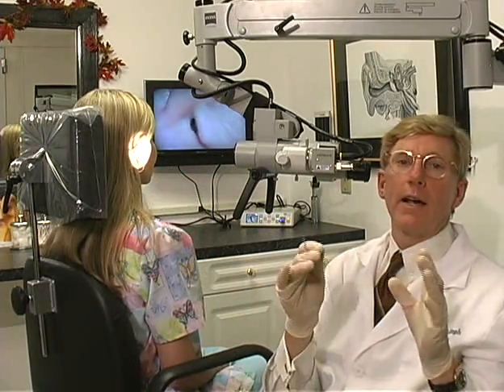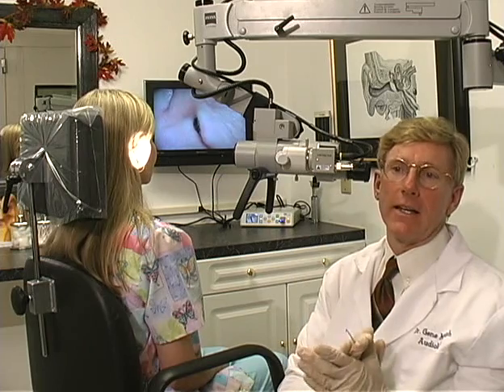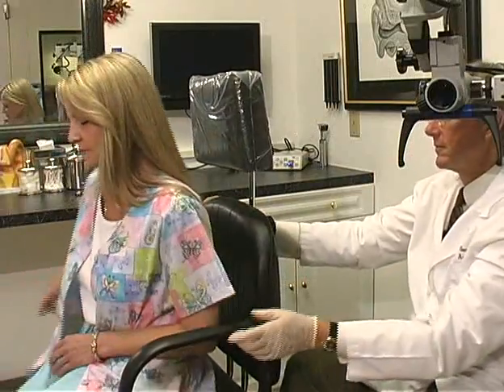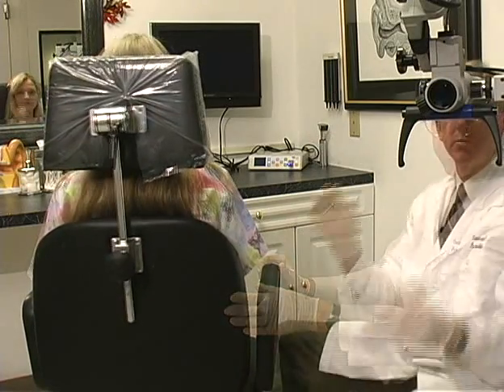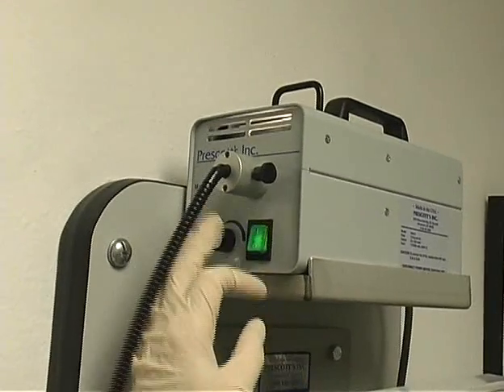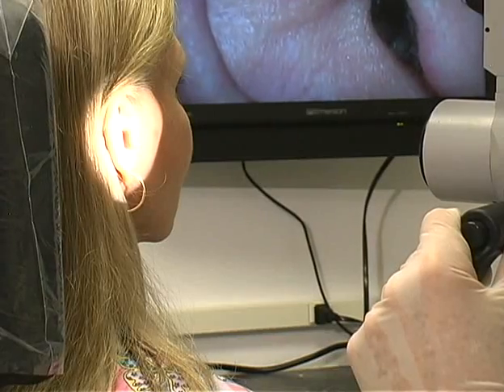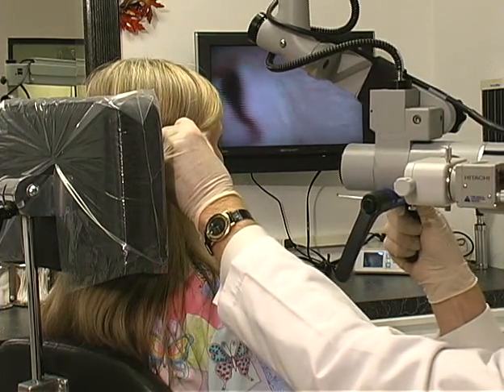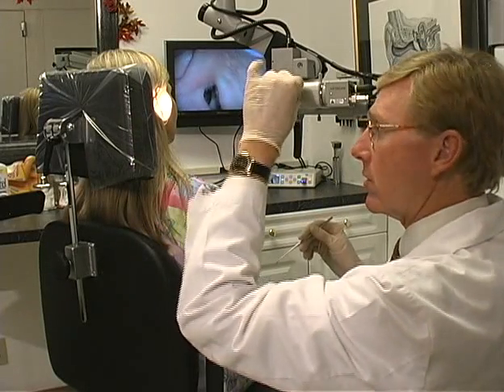You'll find that after only a few weeks you'll be comfortable with this part of the procedure. Let's go over the basics again when you see a patient: first, seat the patient; adjust patient height; extend the microscope's arm and tighten; turn on the fiber optics light; adjust the amount of illumination; position the light on the patient's ear; stabilize your patient's ear while adjusting focus; equalize eye focus; then check the video monitor and begin your examination.